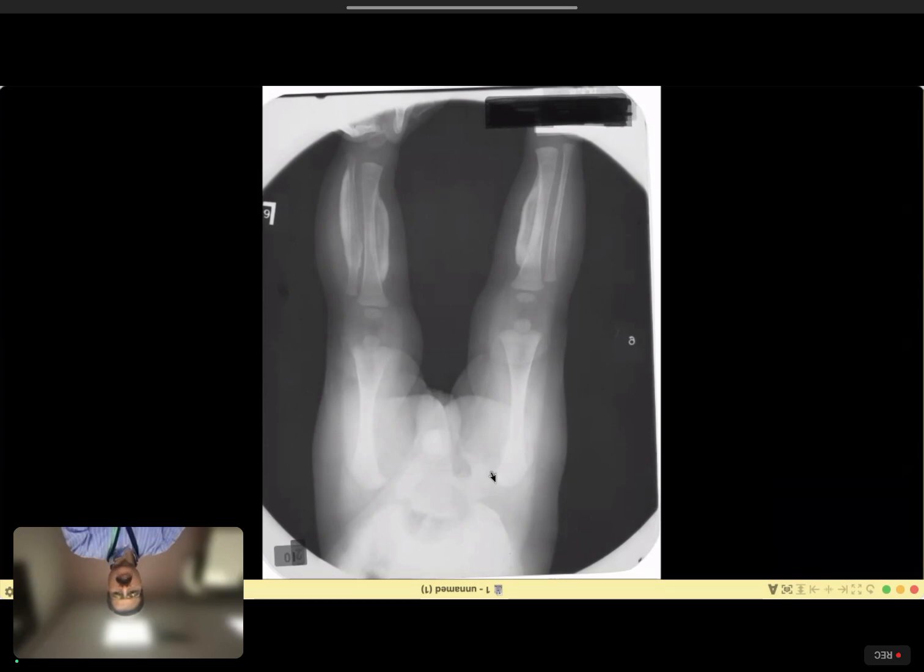So this is a child who is definitely less than 8 months or close to that. With that, you have a periosteal reaction, which is thick. And this thick periosteal reaction is along the diaphysis, and it is not involving the epiphysis. With that, there are pertinent negatives. There are no metaphyseal erosions. Scurvy is ruled out: no Wimberger signs, Pelkan spurs, or Trümmerfeld zone, etc. No cupping, so rickets is ruled out. And of course, ask for a mandible, etc.